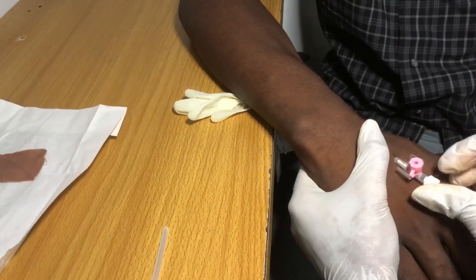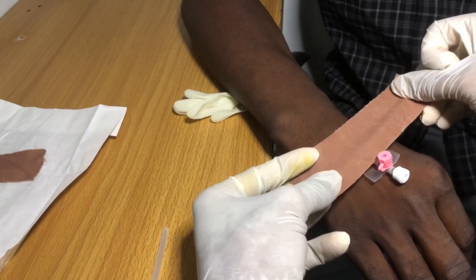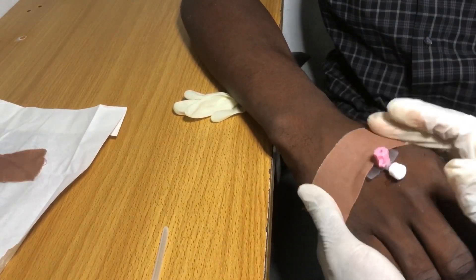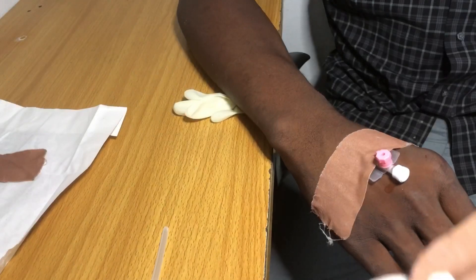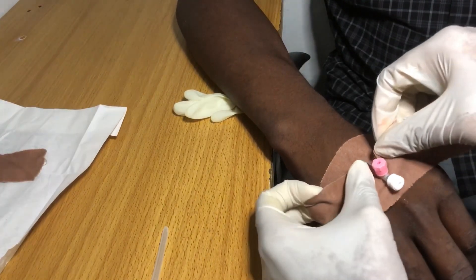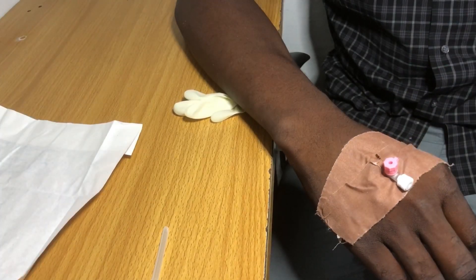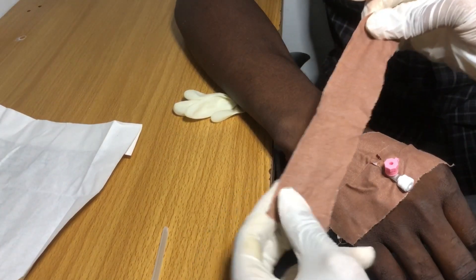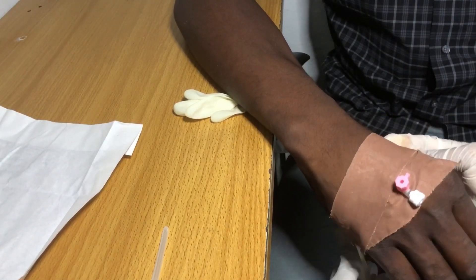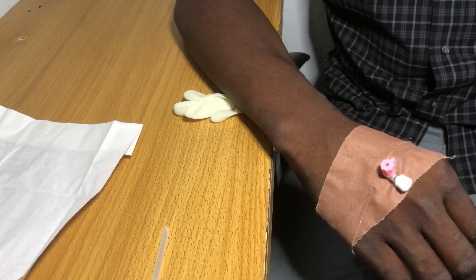Take your saline flush and, stabilizing the cannula with your left thumb, gently flush with about 3 to 4 mls to ensure patency and confirm the line is not in tissue. Next, cap the cannula using the lock and open up the wings, then secure the cannula to the skin with plaster. The first strip goes across the wings and the point of entry. The second strip — called the butterfly strip — is split down the middle and placed under the lock onto the remaining parts of the wings. The final strip goes across both previous strips and the point of entry. Make sure the plaster doesn't form a complete circle to avoid a tourniquet effect and reduce the risk of tissuing.